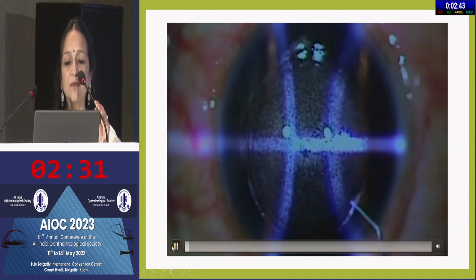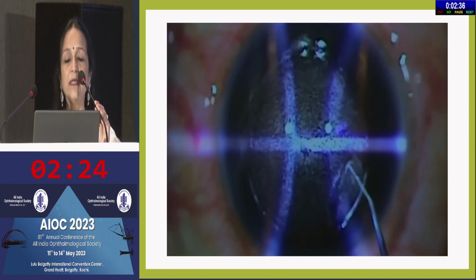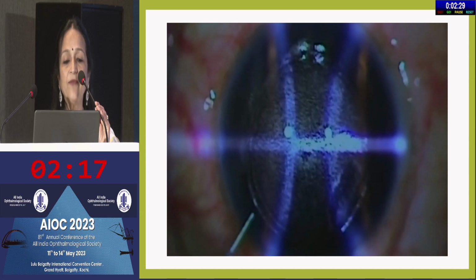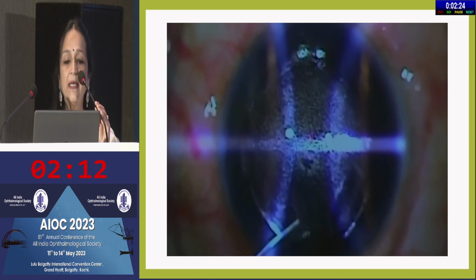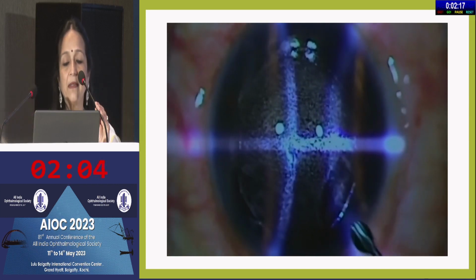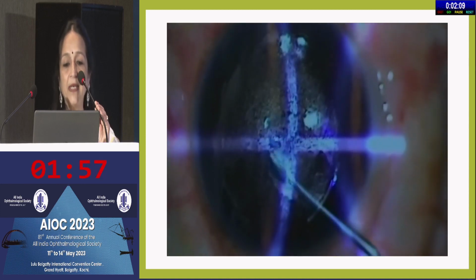This is the video courtesy Dr. Kumar. The first incision, you can see, is doing the upper lenticular dissection. The second incision on the left goes to the bottom plane, and then you can separate out both planes from different incision sites. Sometimes if the lenticule is getting stuck on the surface up, this will prevent it from happening.